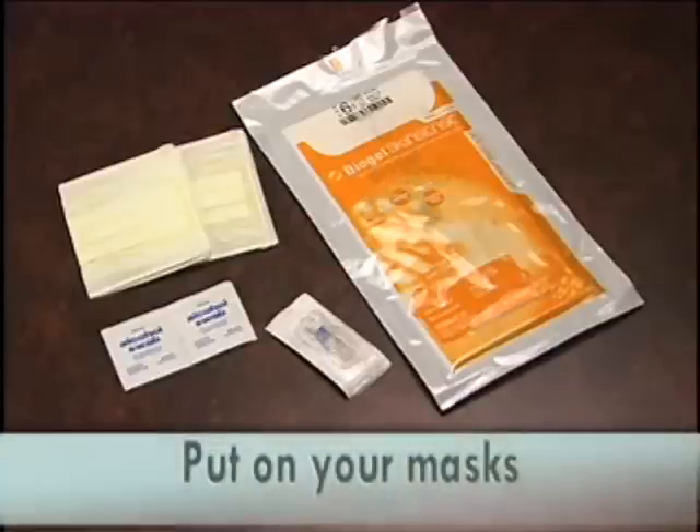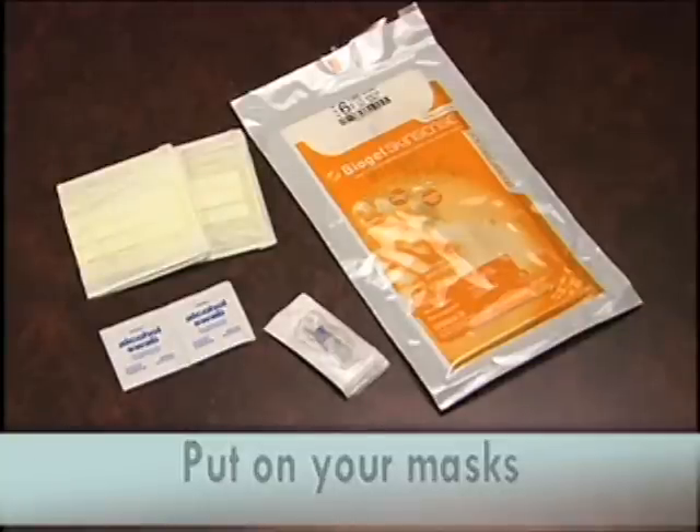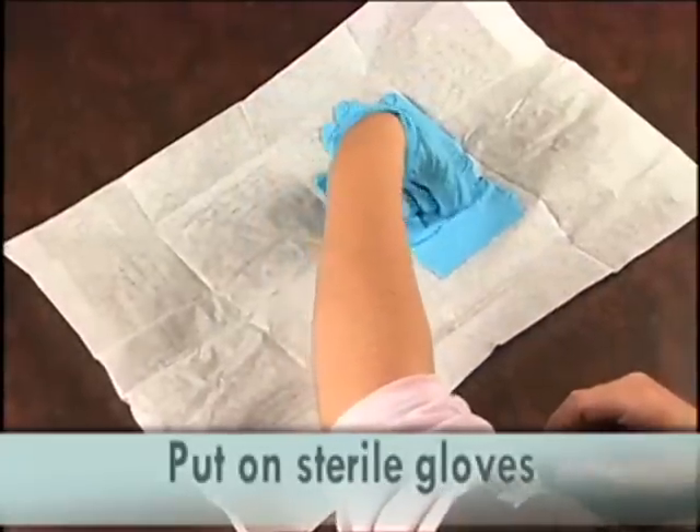Put on your mask. Your assistant needs to don a mask as well. Put on your sterile gloves.